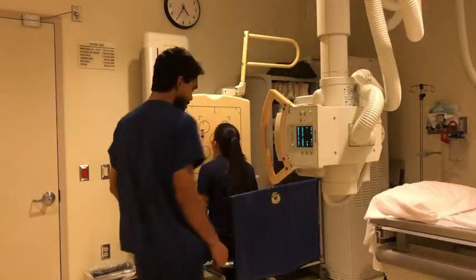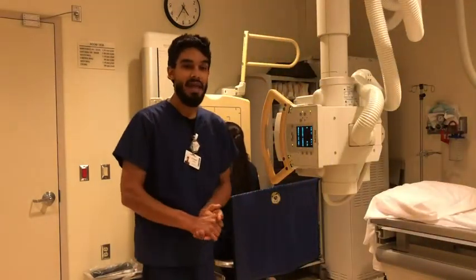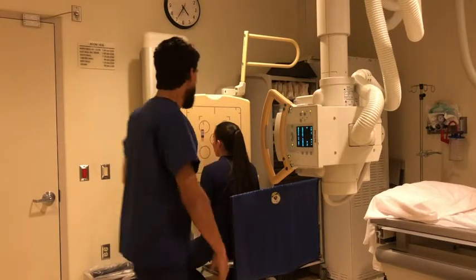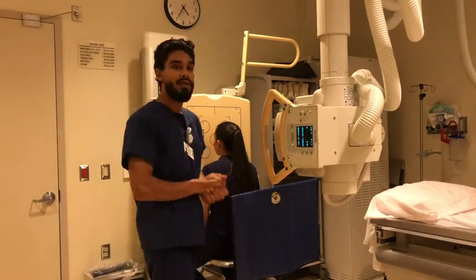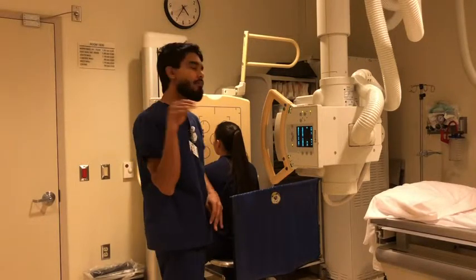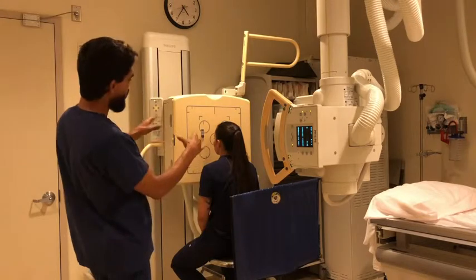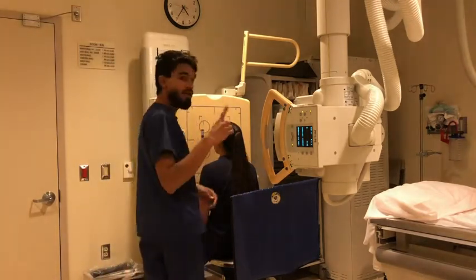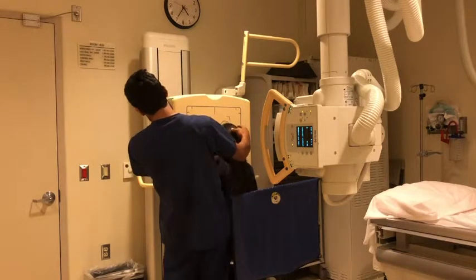Okay, so for our next view, we're going to be doing a parietoacanthial image. So for this, we want the MML to be perpendicular with the IR. So again, she's going to have to look up a little bit more.